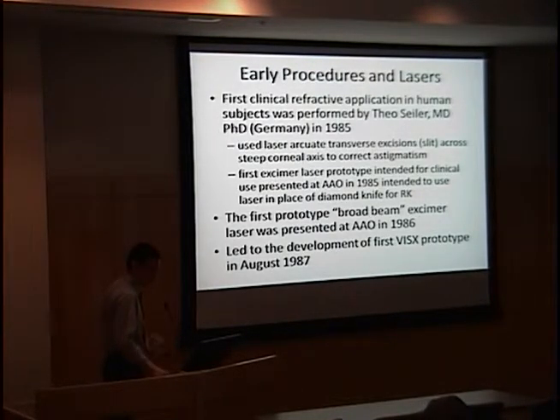So the first clinical refractive application in human subjects was performed by Dr. Seeler in Germany in 1985. And he used, how do you actually pronounce that? Seeler, okay, thank you. He used the laser to create arcuate transverse excisions.